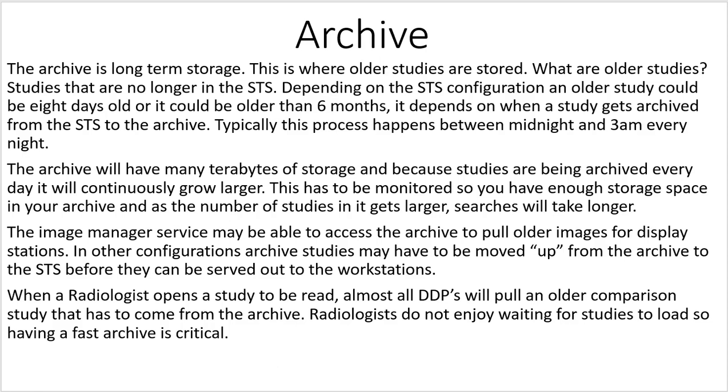The Image Manager service may be able to access the archive to pull older images for display stations. In other configurations, archive studies may have to be moved up from the archive to the STS before they can be served out to the workstation. So basically, it can go directly from the archive to the workstation, or it has to be pulled up to the STS before it can go out to the workstation. It's really dependent on your configuration. When a radiologist opens a study to be read, almost all digital display protocols, or DDPs, will pull an older comparison study that has to come from the archive. Radiologists do not enjoy waiting for studies to load, so having a fast archive is critical.